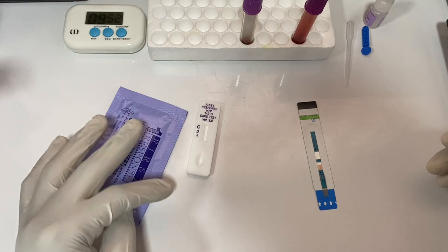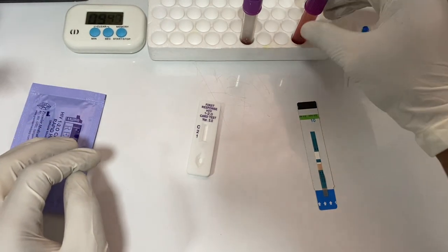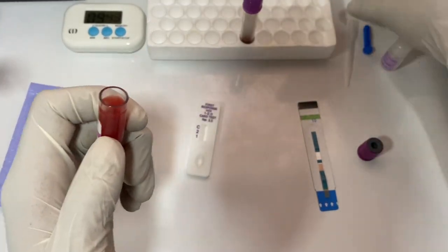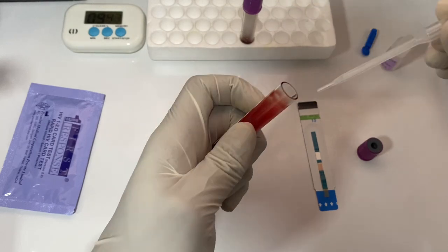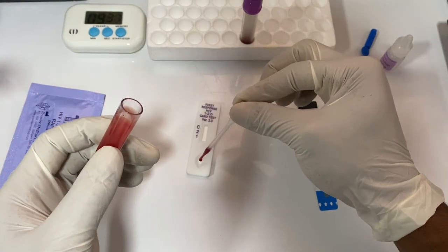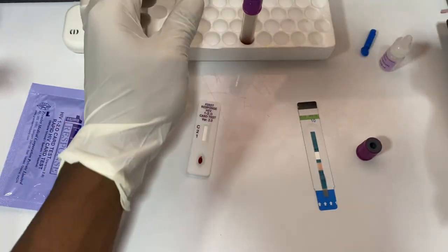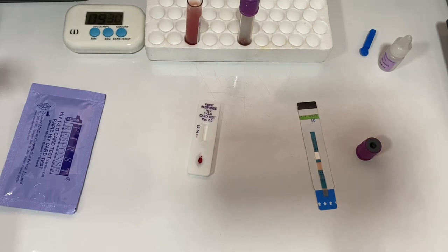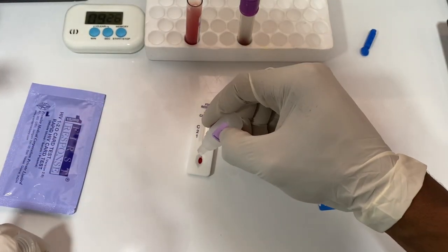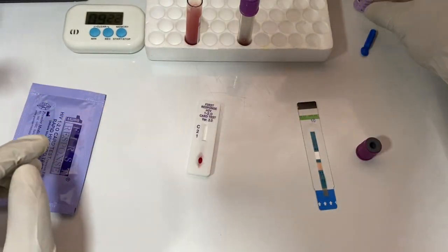So while that one is running, we'll do the second strip. For this one, you can apply whole blood directly, and then there is a buffer here that you also put inside. Just a drop of blood is enough here, and then you apply your buffer — two drops is enough. You also wait for the same amount of time.